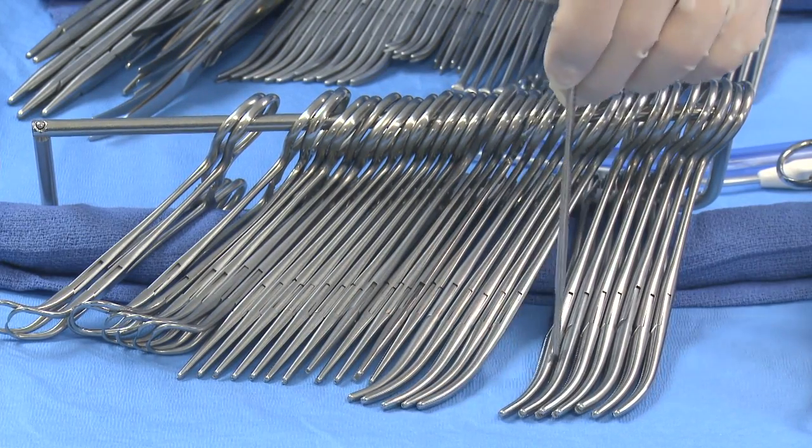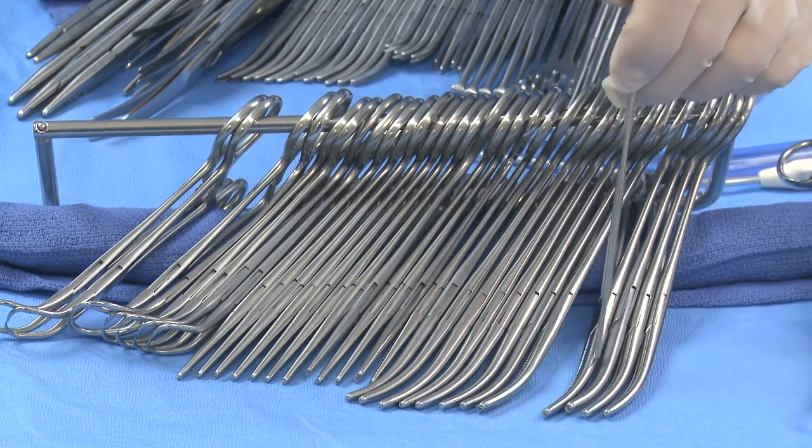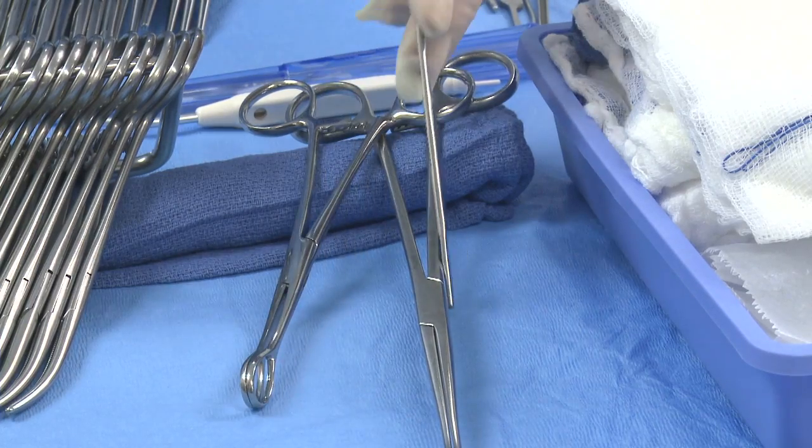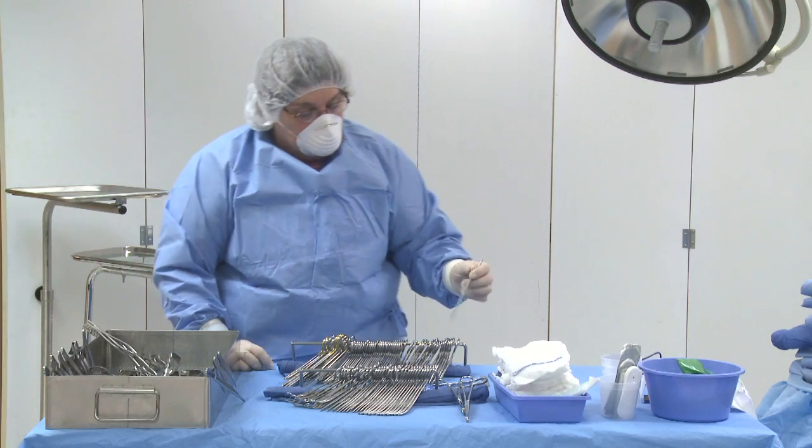1, 2, 3, 4, 5, 6, 7, 8, 9, 10, 11, 12 kellys. 1, 2 sponge sticks or sponge forceps.